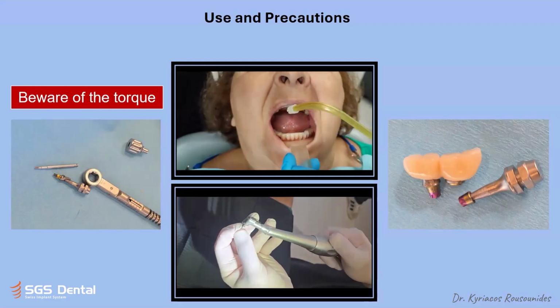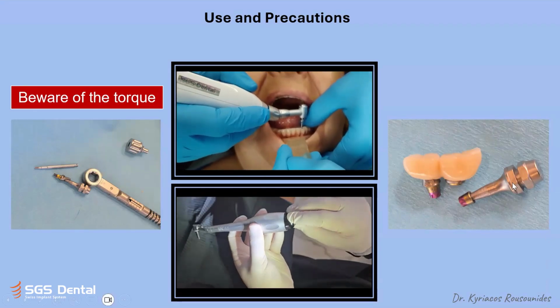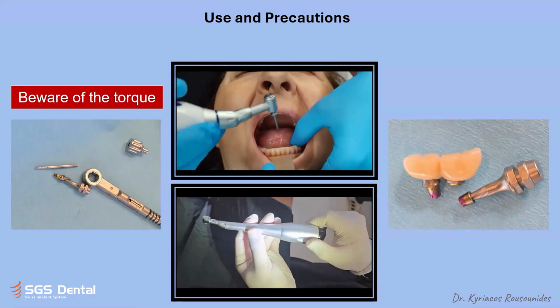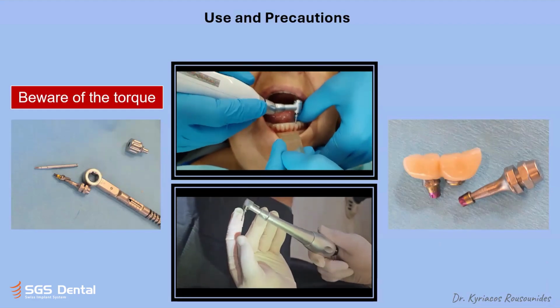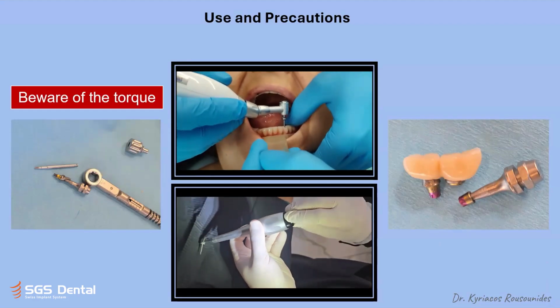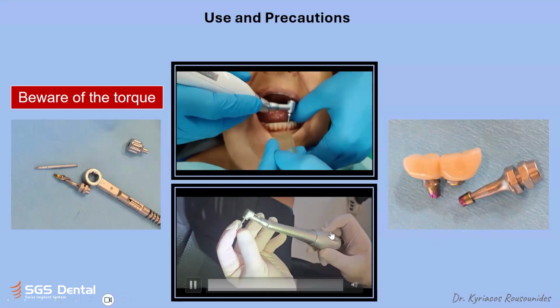I don't know when exactly, but we are trying to develop some of these parts to be either in our surgical or in an external kit, especially for broken parts, like everything as a rescue thing for prosthodontists and surgeons.